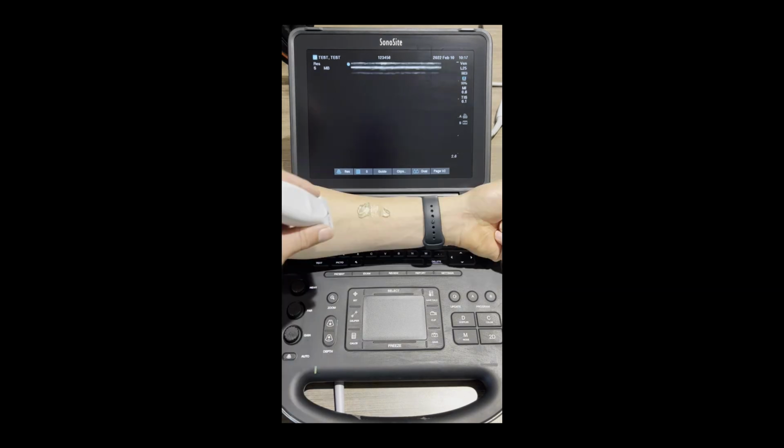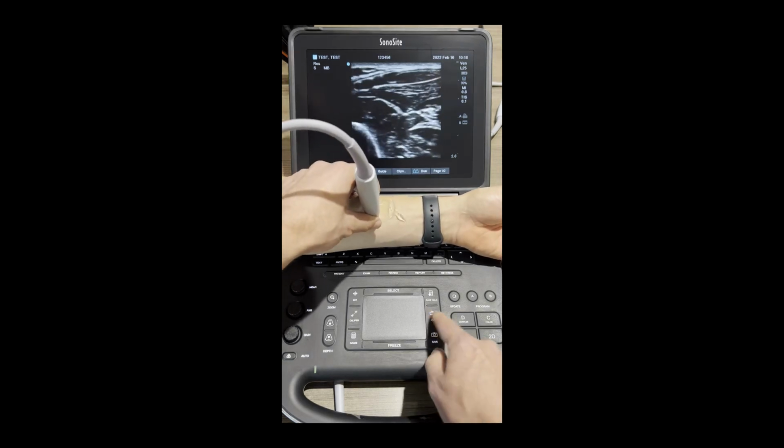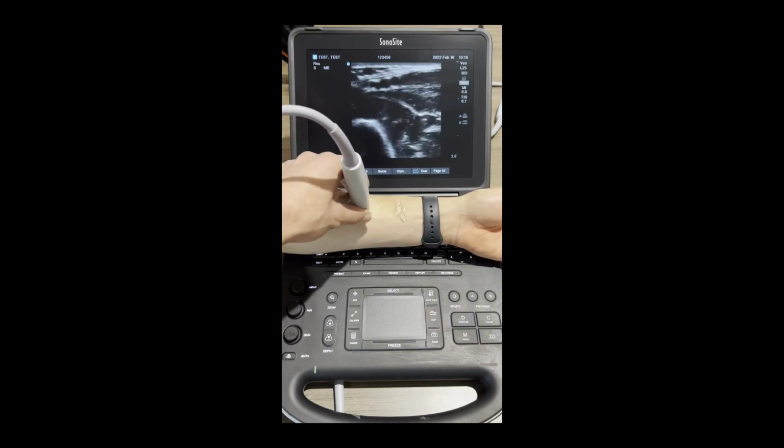Now we're going to talk about how to save images. It's important for any of your studies to make sure you save exemplary images of either normal findings or pathologic findings. In general, video clips are going to be preferred as this provides more information. However, if you are doing a measurement, then you can do a still image. So in order to save video clips, you're going to push the clip button and it's going to record 4 seconds proactively.